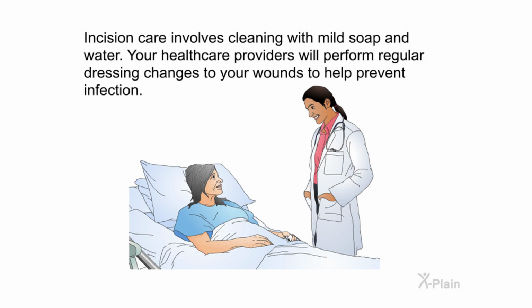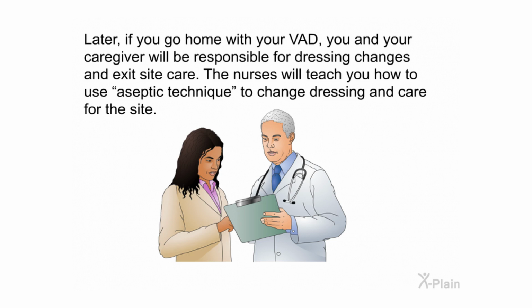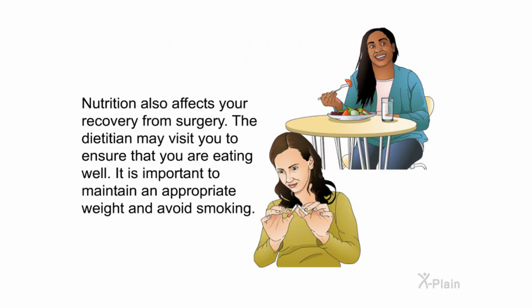Incision care involves cleaning with mild soap and water. Your healthcare providers will perform regular dressing changes to your wounds to help prevent infection. Later, if you go home with your VAD, you and your caregiver will be responsible for dressing changes and exit site care. The nurses will teach you how to use aseptic technique to change dressing and care for the site.